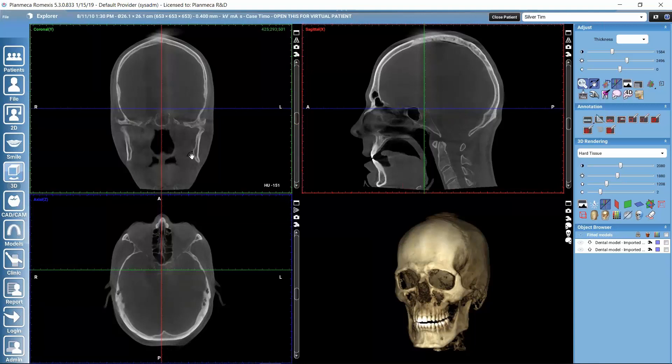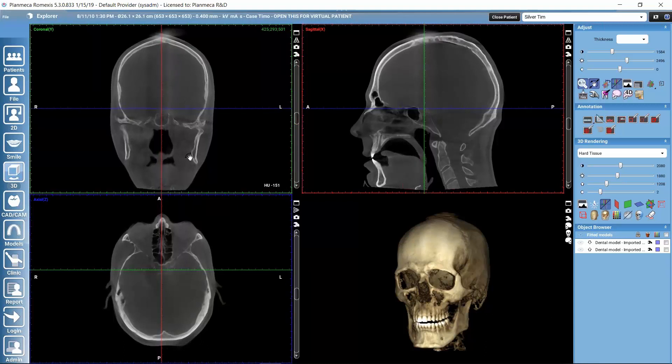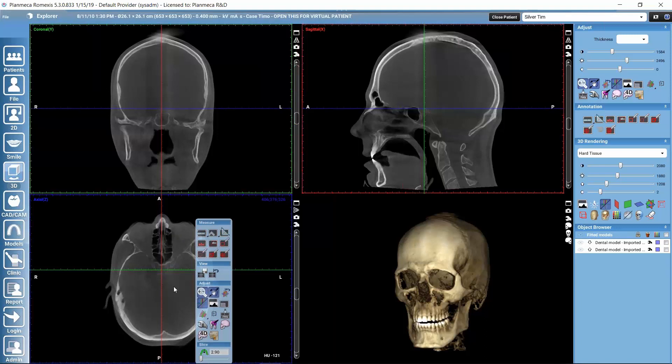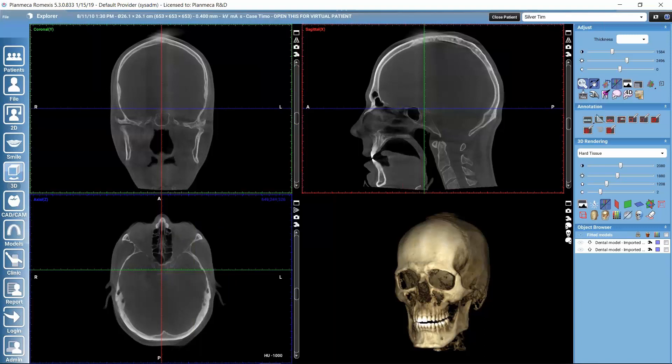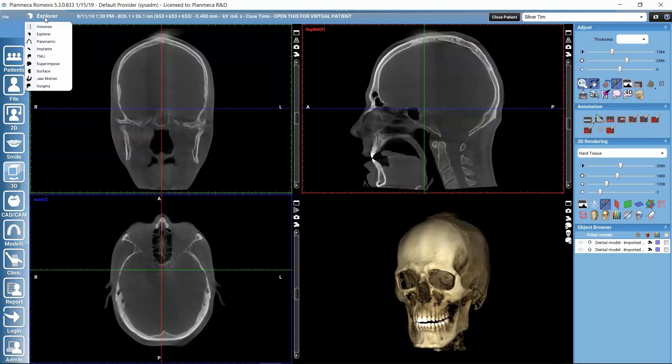If you would like to align or rotate the volume, for example a little bit here on these views to get the orientation more symmetrical, we can do it here in the Explorer submodule and then we could click here on this export view to other tabs. Then we would get the orientation that we defined here also to TMJ submodule. Let's then click here and select TMJ.